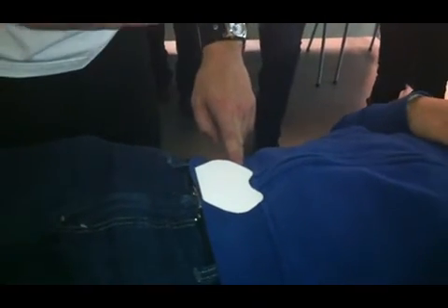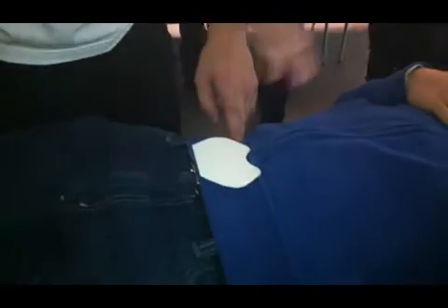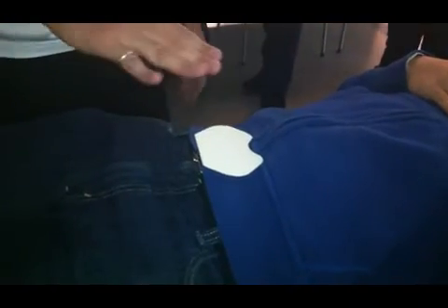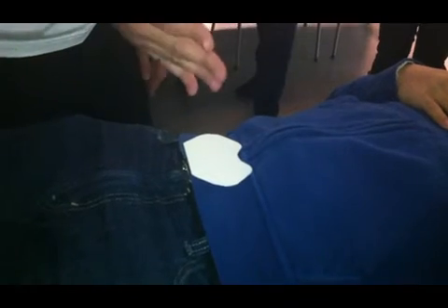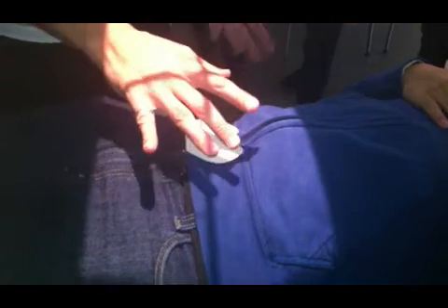As long as you're on that, this part will usually take care of itself. But you can use the symphysis and go up that way too. As long as you're along the top border of the symphysis, the superior part, then it'll be properly positioned there too. And then it's just a matter of getting it midline. So for him, about right there. Her, about right there.